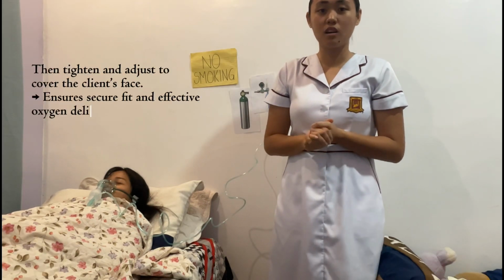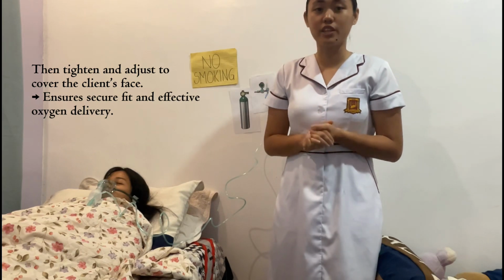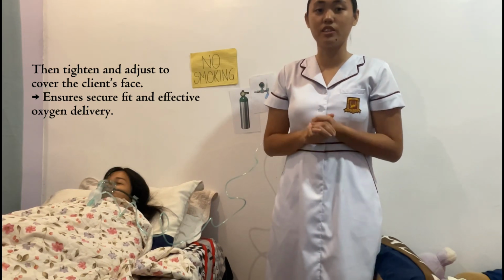Tighten and adjust to fit the client's face. So this is to ensure a secure fit and effective oxygen delivery.